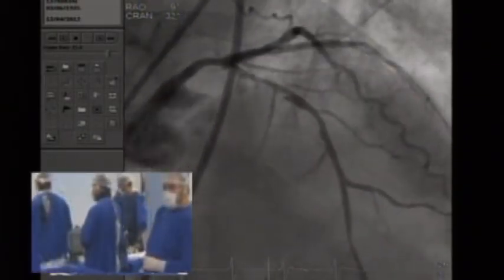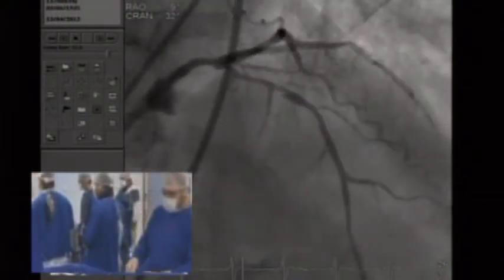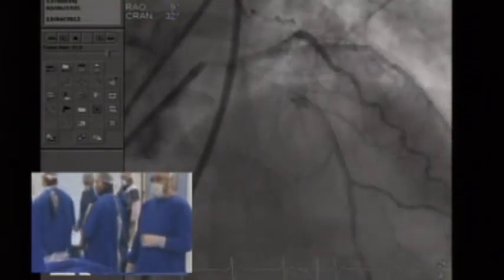You know, for this distal lesion, perhaps a gentle drug-eluting balloon there. What do you think, Pedro? Is this a good indication for a drug-eluting balloon, that distal small vessel focal lesion? The distal LAD. If it looks good, you leave with a drug-eluting balloon, or you would stent? Perhaps, Alex, but I wouldn't do it. You would? If somebody tries that, I'm okay, but I wouldn't. I mean, it's a lot of stents. Patient will be on Plavix anyway, so I just stent it. Oh, so you'll stent it.